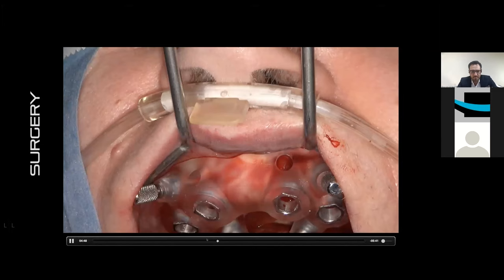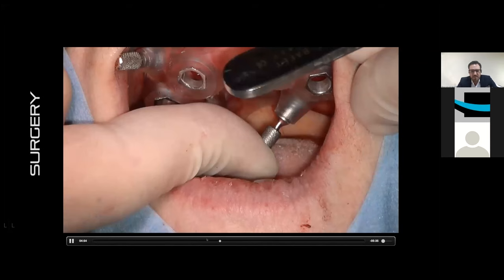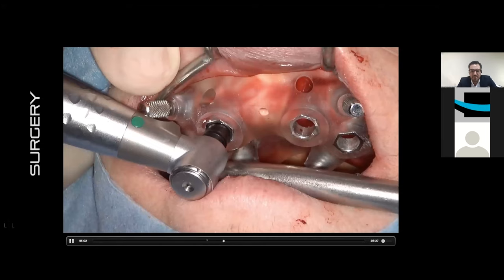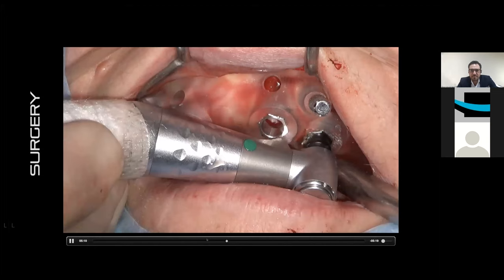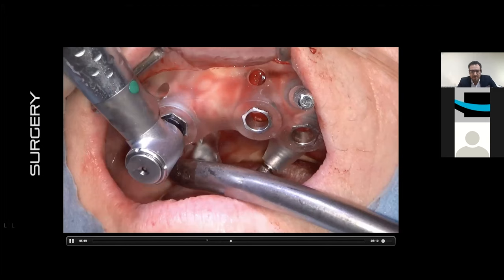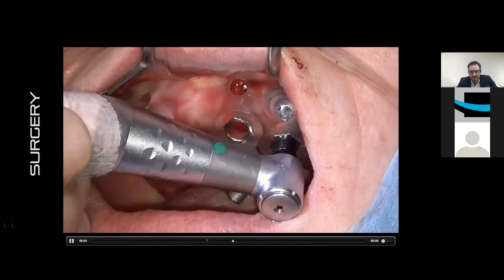As can be seen from the template sleeves, it's a very old case that I am proud to show you, because it represents one of the first cases about 3 years ago in which the full digital implant workflow was described. To date, we adopt surgical templates that present more performing sleeves, for example, sleeveless surgical templates or decomposable surgical templates that allow you to approach any surgical case from the simplest to the most complex ones.